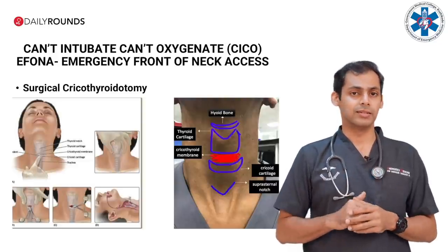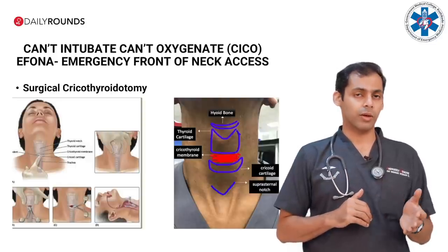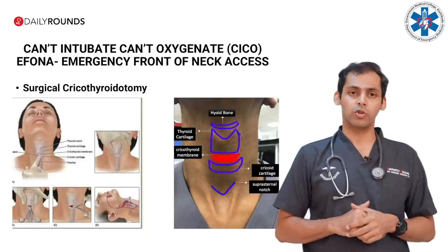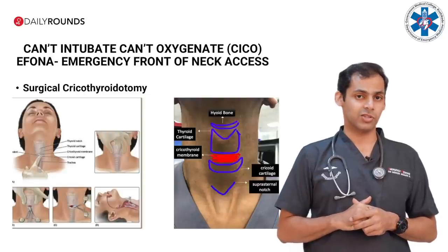Communicate clearly. Simple instructions, closed-loop communication, adequate volume without shouting is essential. Place a nasogastric tube after tracheal intubation is completed and ventilation established safely. If COVID-19 status has not been already confirmed, then take a deep tracheal aspirate for virology using a closed suction. Closed suction, if available, is preferred for clearing the tracheal tube compared to open suctioning.